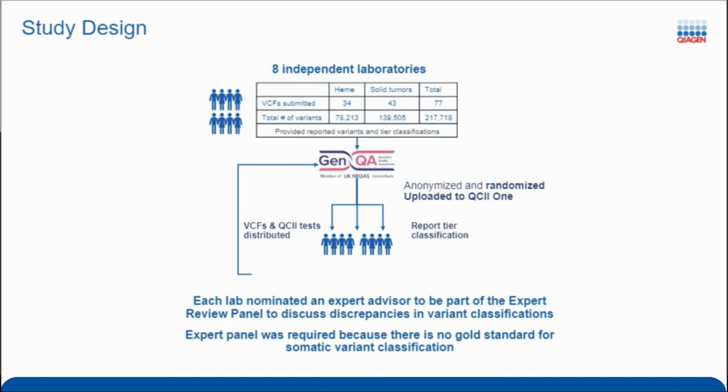Well, it might be. And another software might say, this is at 5.1%, and therefore it reaches some threshold for significance. So I think one level that makes it hard is that for borderline things, there's technical variation, and that can lead to a lot of confusion. Is this a real variant or not, or is it important?